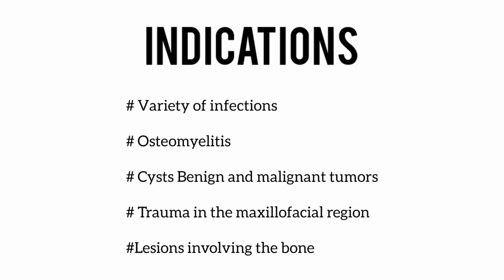So what are the indications? It can diagnose a variety of infections, osteomyelitis, cysts, benign and malignant tumors, trauma in the maxillofacial region, lesions involving the bone, and it is used in the treatment of congenital and acquired deformities.